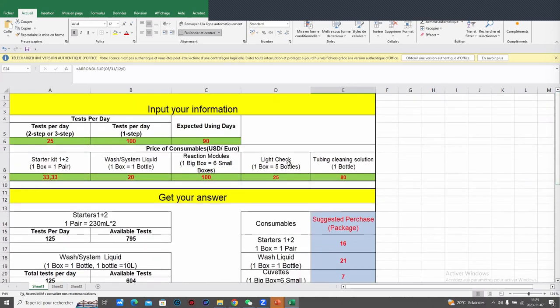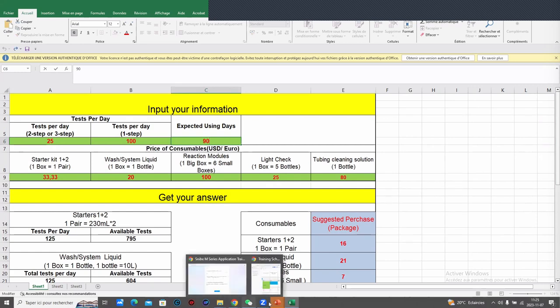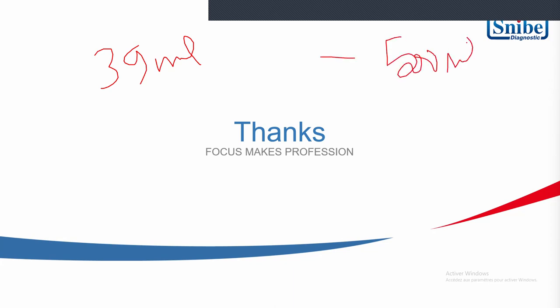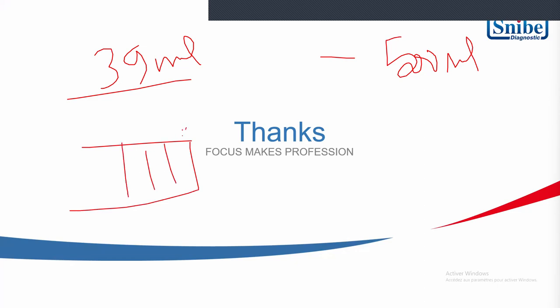For the tubing cleaning solution, we said it is monthly maintenance. So each month it will consume 39 milliliter. And the bottle of tubing cleaning solution has 500 milliliter. Then if it's Maglumi 800, because we said we put in the vial number 7, 6, and 5, 13 milliliter in each vial.